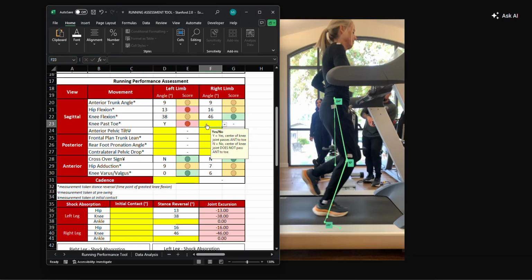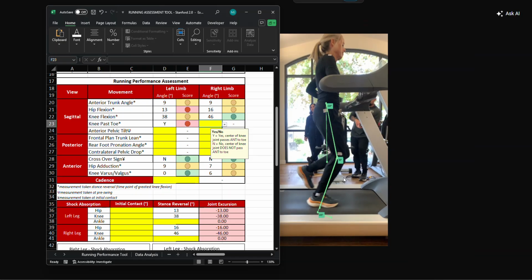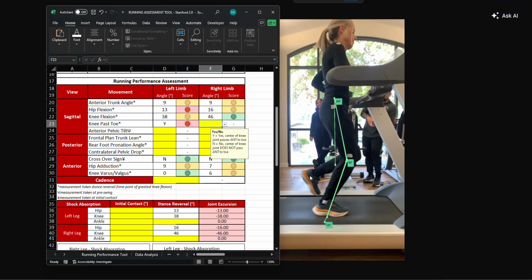So a little bit more compliant on the right leg as compared to the left. And I recognize that the lines aren't matching up. It's just because it's a screenshot. But when it was actually measured, the angles were properly matched to the joint center angles. And in fact, it may be because I had zoomed in on it. I'm not quite sure, but then we're at 105, which would be 15 degrees of dorsiflexion.